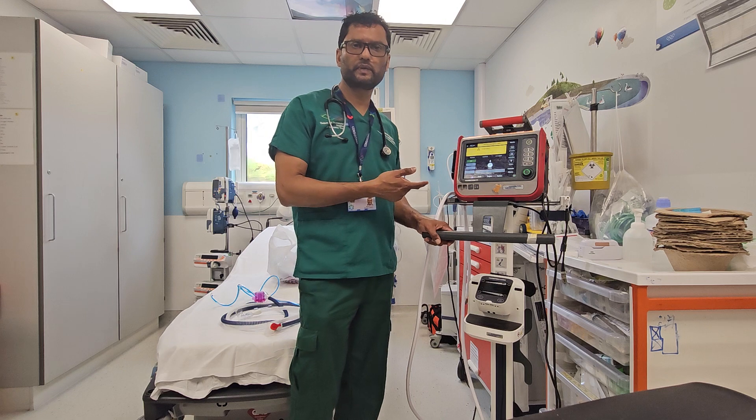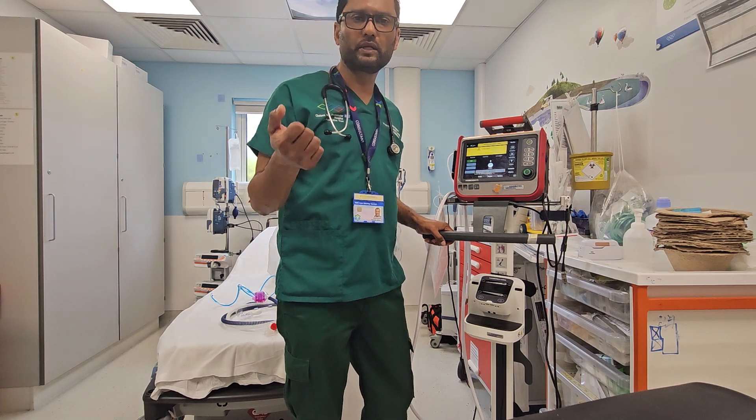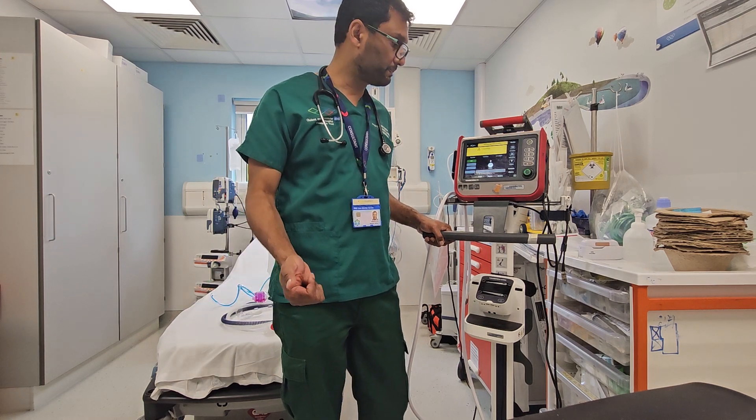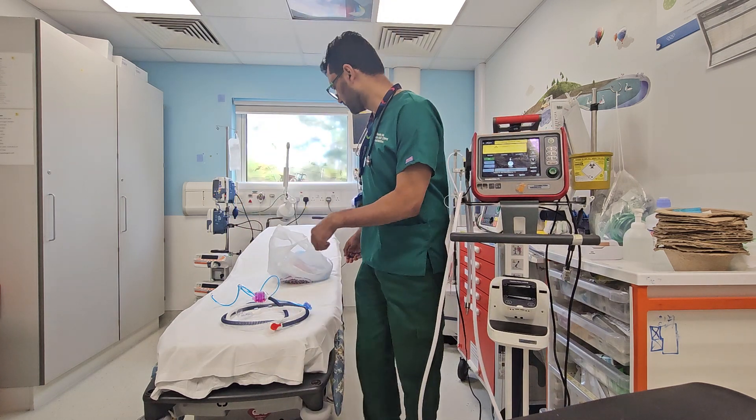This ventilator can ventilate from 0 to over 100 kilos, and it can do invasive ventilation, non-invasive ventilation including Optiflow and CPAP. It's a very good ventilator, and there are two circuits which are mainly used.